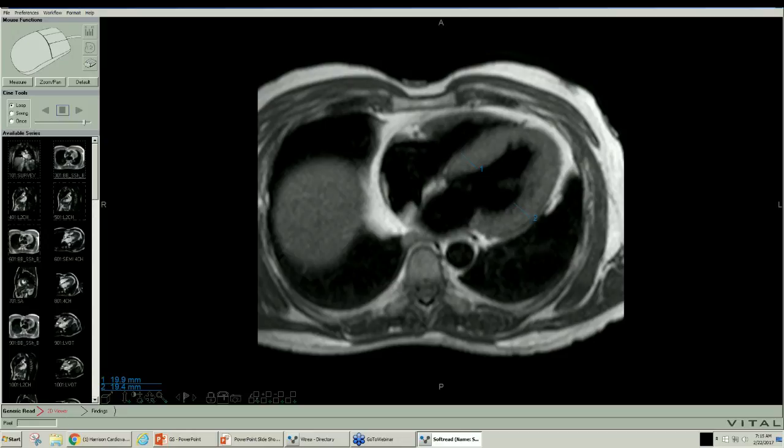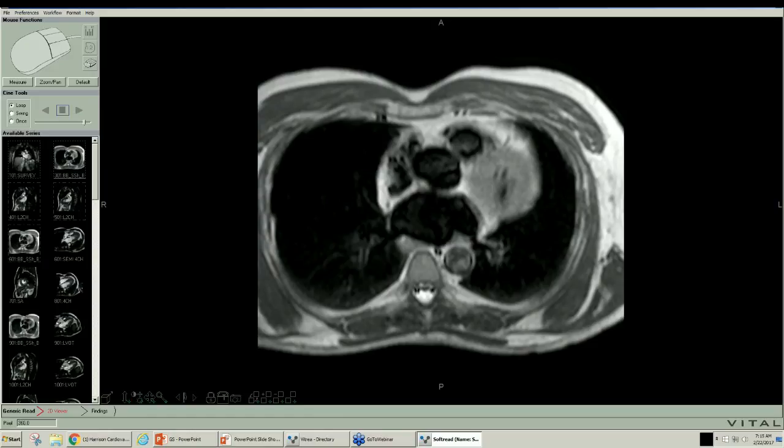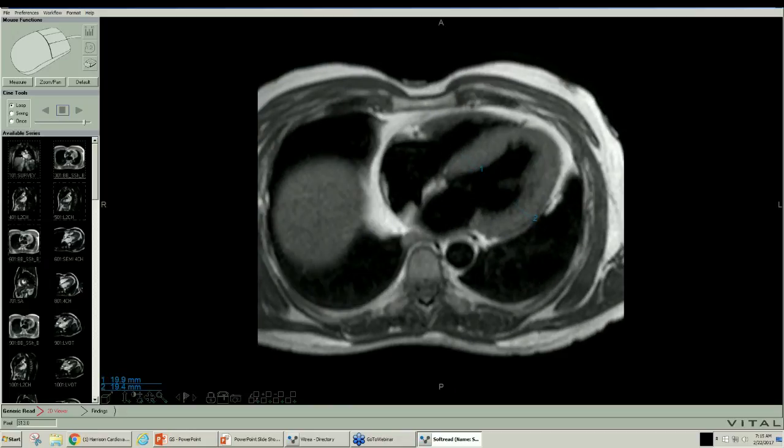So there's no question there's left ventricular hypertrophy. There's no question that it's extreme. And there's no question that it's concentric. This is not the picture that we see with hypertrophic cardiomyopathy. So let's flip through some of these and see what we can make out. There's our left atrium. We can drop a line on the left atrium, sort of perpendicular. And we'll say it's elevated. So it's greater than 40, 45.7. So we have left atrial enlargement, goes along with the EKG, goes along with the echo. Good correlation. Here's the foramen ovale area.